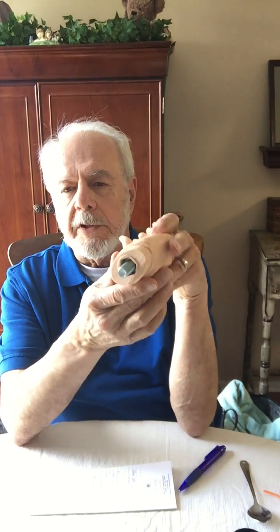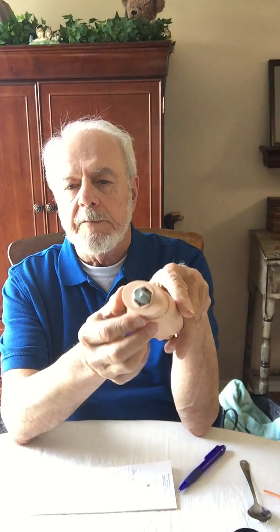We have had some earlier presentations of things that would be accessories for you to test out terminal devices, and we've upgraded that, and I'd like to share it with the whole community as well as the people that are working on the challenge. First of all, to show you a little about a terminal device, Justine mentioned that there's a standard screw that connects the terminal device to the rest of the prosthesis, typically the socket that goes on to the user's residual limb.